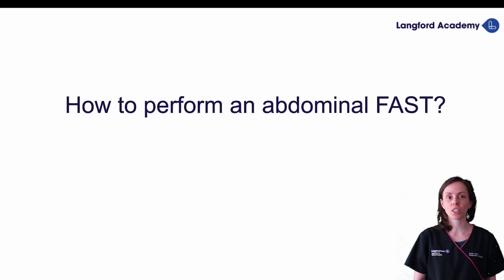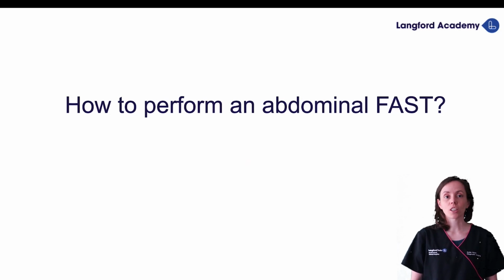Following the first video, we're now going to perform an abdominal AFAST to try to determine why this abdomen is distended. So at this stage you might want to know how to perform an abdominal FAST. That is what we're going to see in this video.